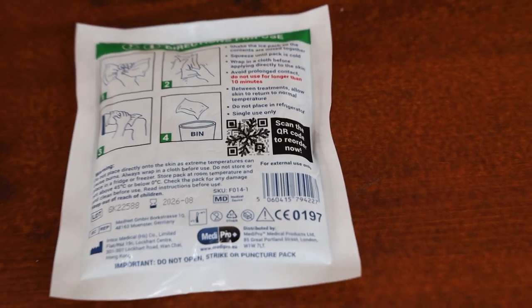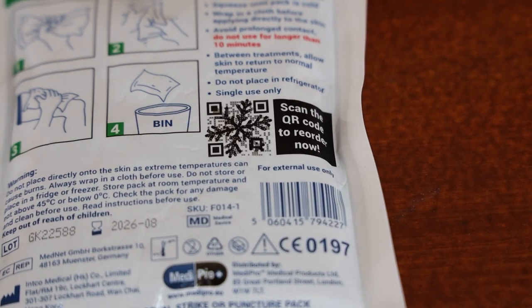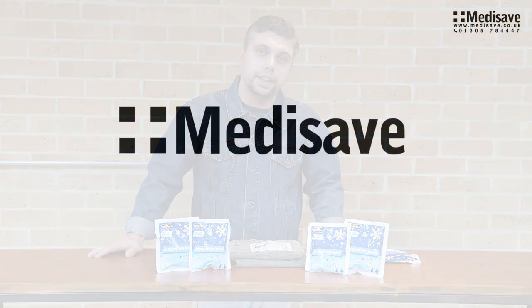On the reverse of each ice pack, there is a handy reorder QR code. Order yours today at medisave.co.uk. Thank you.